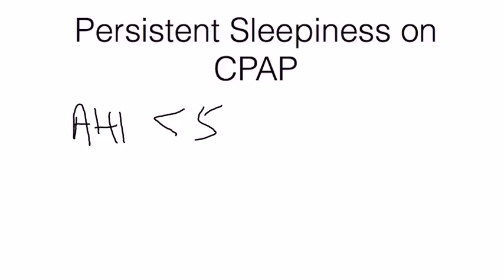Another issue that may develop that may cause the AHI to go up is the conversion of obstructive sleep apnea to central sleep apnea, which is called complex apnea. Most patients take about a few weeks to months to acclimatize to this. However, there may be some patients who require repeat in-lab study to assess for this.